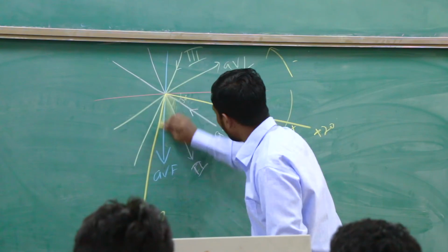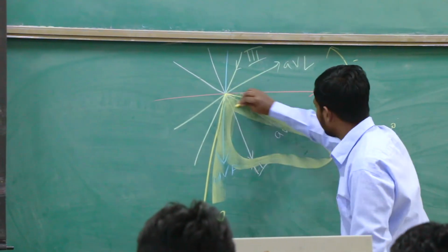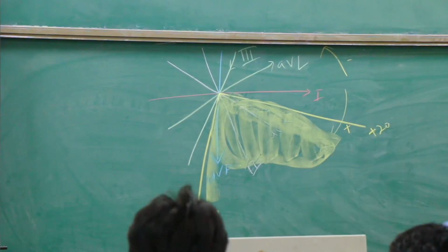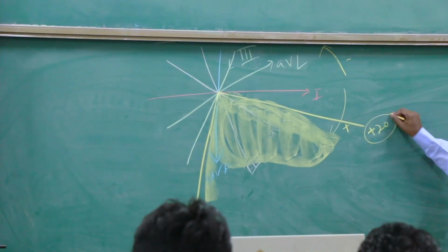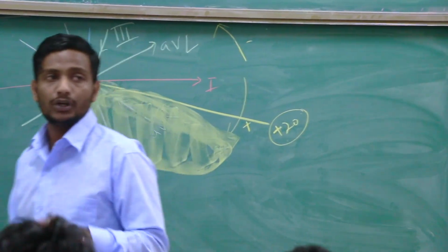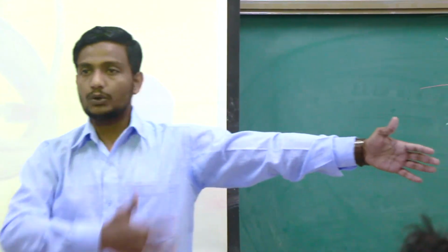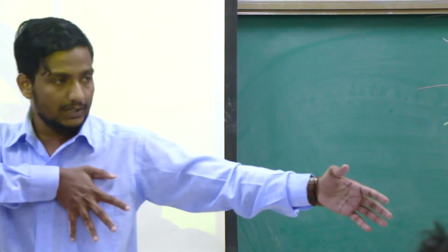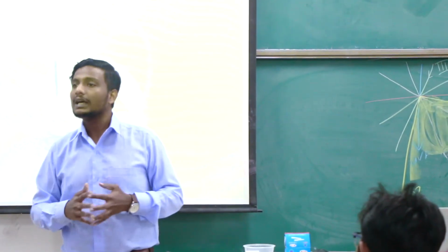So this is the area where your heart lies. This is the area of your heart, like this. Your heart lies between lead 1 and aVF, more specifically from plus 20 degrees to how much? Plus 100 degrees. So this is the normal axis of your heart. If I am standing here and all these leads are looking at the frontal view, my heart is like this, from plus 20 to how much? Plus 100. This is the normal axis.